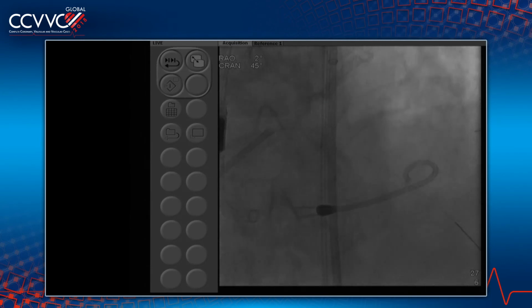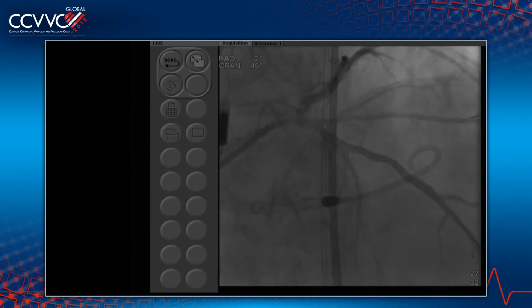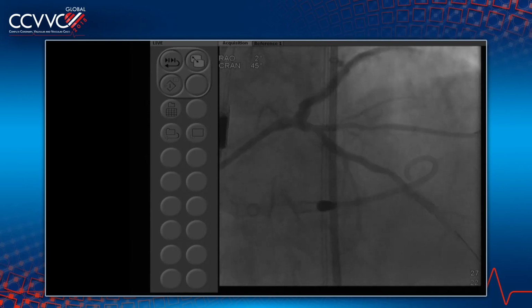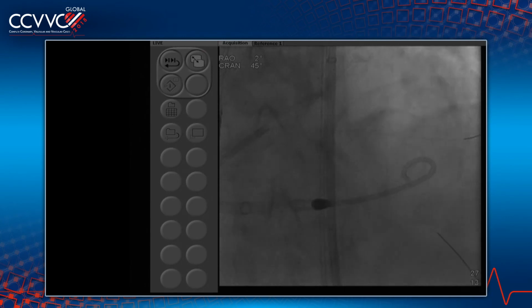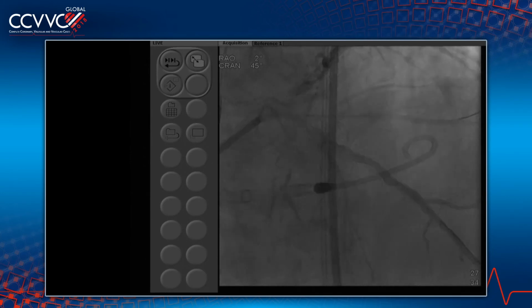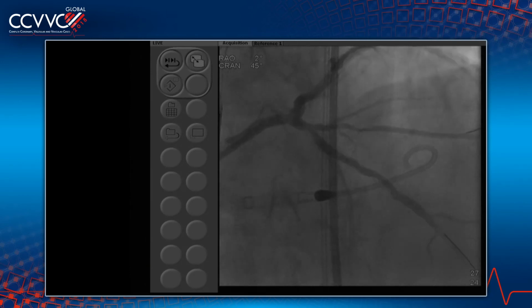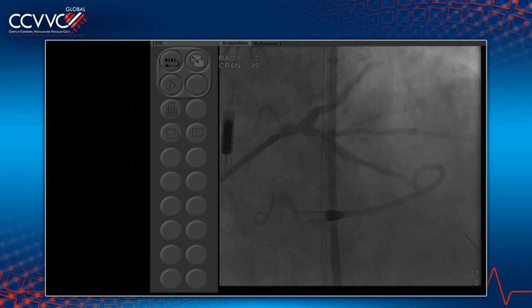Okay. Now, if you go with imaging, at the level of the LAD it is 4.7 there. So that's large, right? At the bifurcation, you definitely see the ostium of the diag is involved, although to really understand how bad the ostial disease is, we have to do the OCT of the diagonal. I think the LAD has diffuse disease, and that's the reason why the FFR is low. I don't really see a discrete lesion. No. I mean, you can stent the whole LAD long and maybe get the FFR a little better.